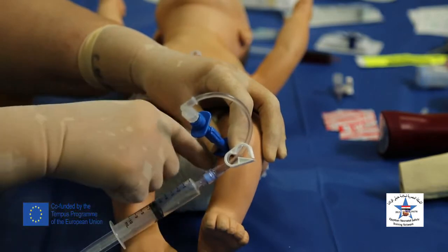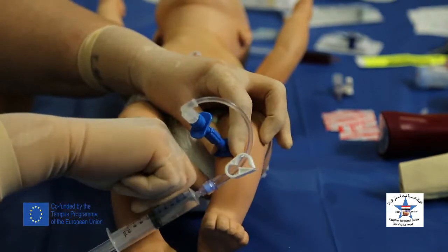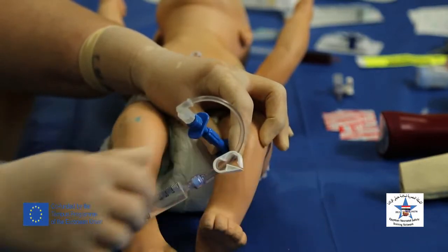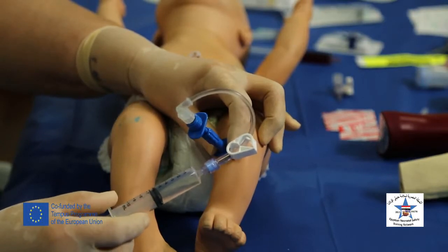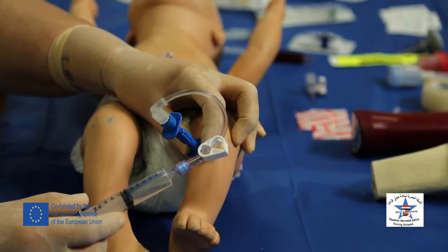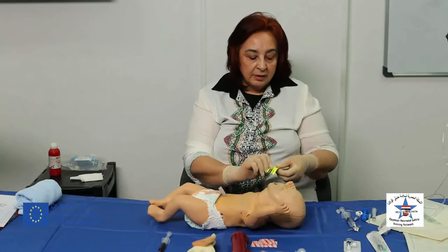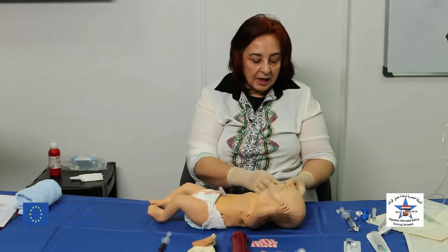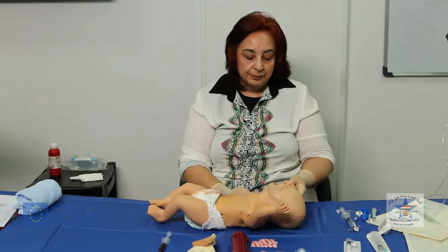We will have to observe the surrounding tissue and the calf area of the skin and palpate it for any firmness. If this was not noticed and extravasation is already going on, this will lead to the so-called compartment syndrome. Then we apply a band around the wrist of the baby and label on it the date and time of insertion.